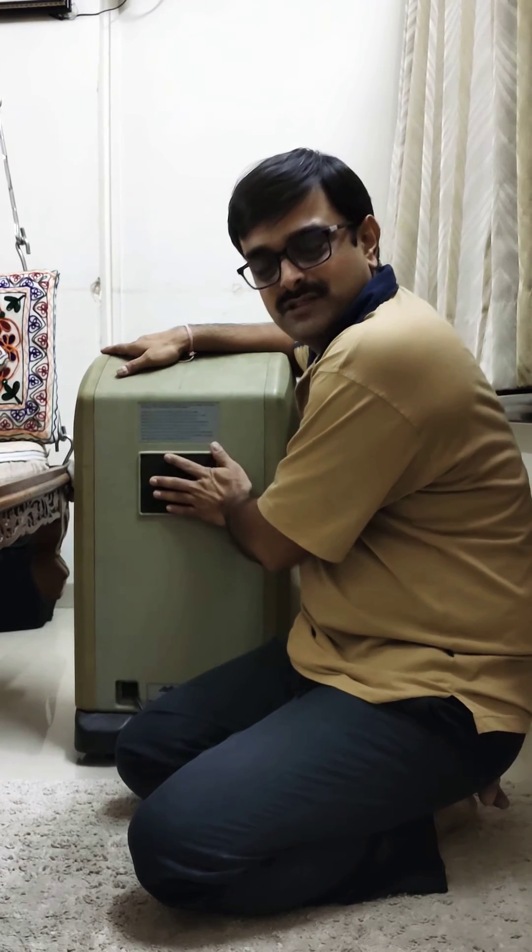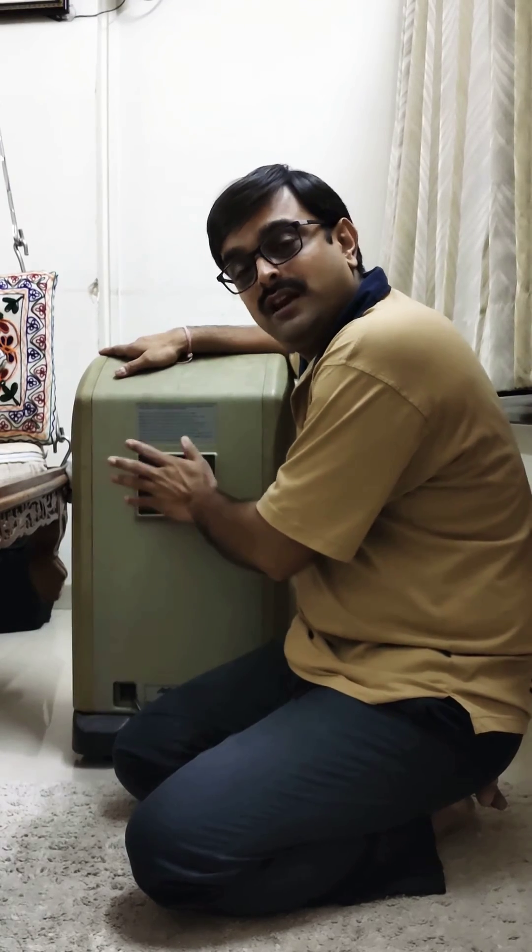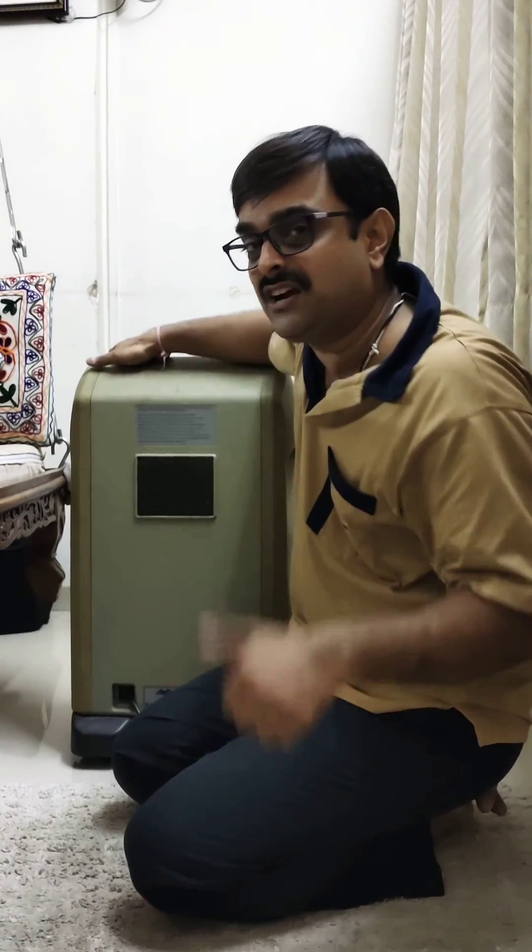If you have some time — say six to eight hours — then you can completely wash it also. But before refixing it, you have to make sure it is completely dry.